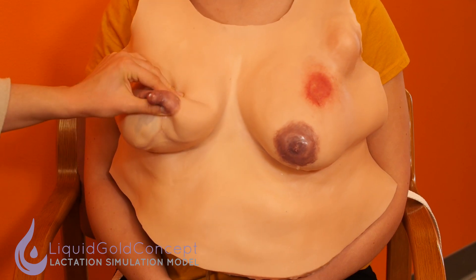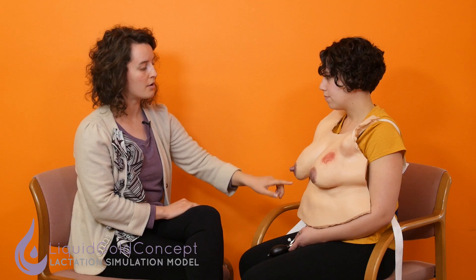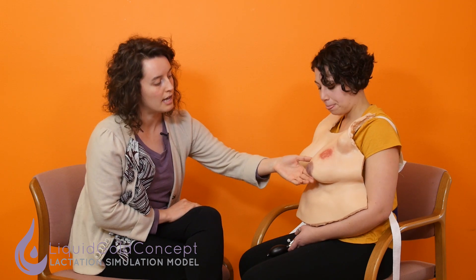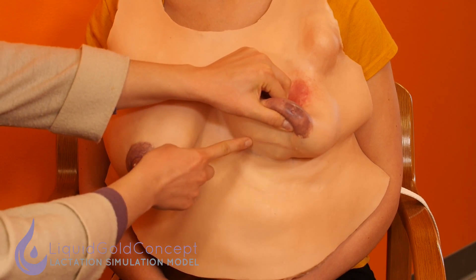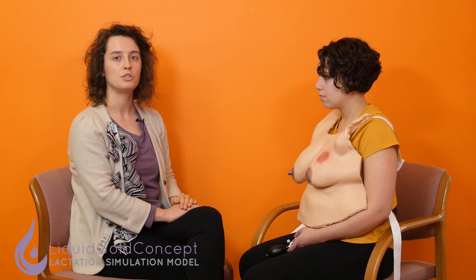Beyond that, on our right breast we have a peri-areolar and anchor incision scar, which is a really important part of the Advanced LSM training. We really want all of our providers to learn how to do a comprehensive breast exam, which involves looking at both breasts simultaneously and underneath the breast tissue. When you do that on the left LSM, you'll notice there is an incision scar there as well. So your learners will need to be very careful when examining the LSM to ensure they can counsel patients appropriately depending on what pathology they find.